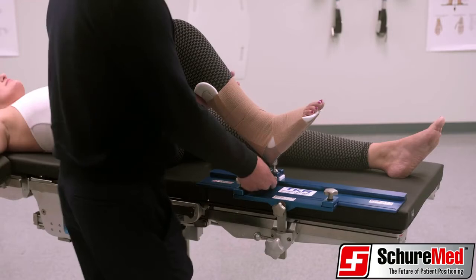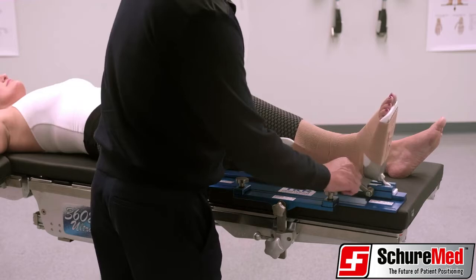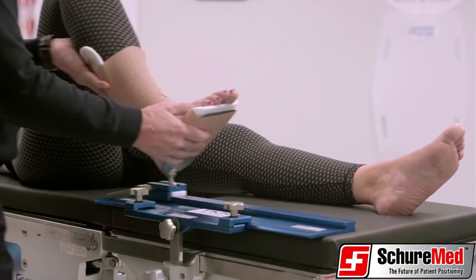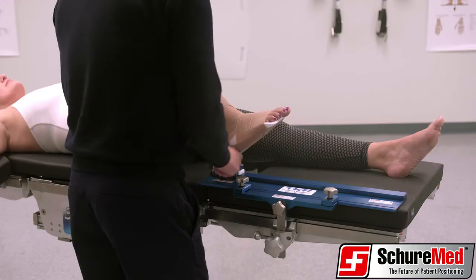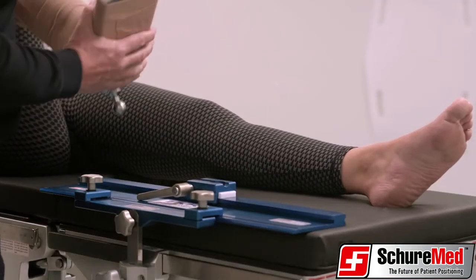After lining the stainless steel boot with SureMed's sterile disposable boot liner and securing the patient's foot into the boot, the patient's operative leg can easily be adjusted and precisely secured with the desired amount of extension, flexion, tilt, and lateral medial rotation.